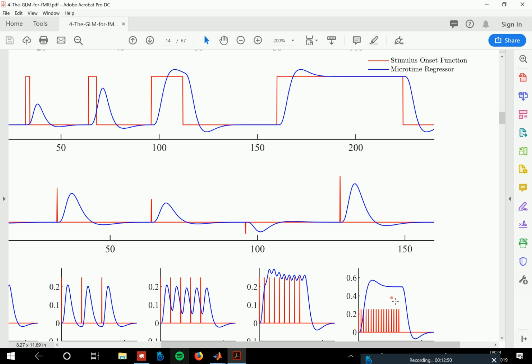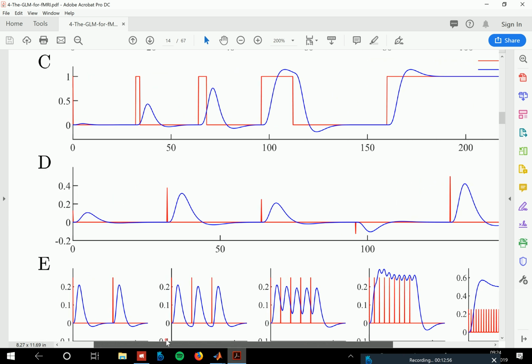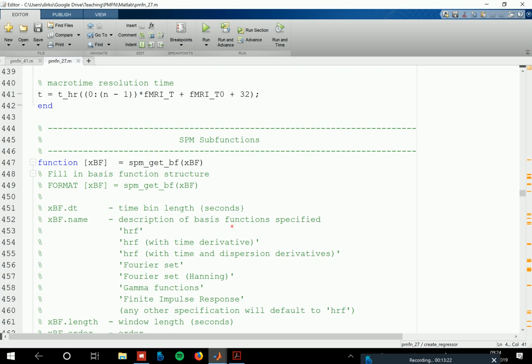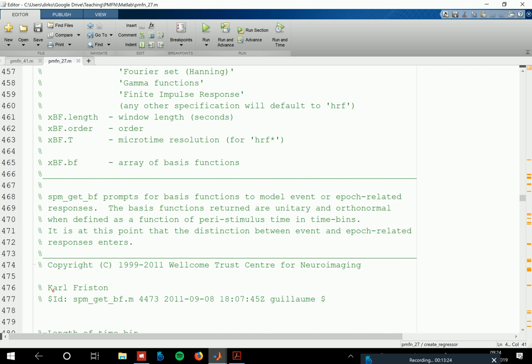you all have the possibility to simulate your GLM, specifically if you are not quite sure whether you should use this extended thing or not, or even just to communicate clearly what effects you want to predict, or how you predict your effects in some fMRI analysis. And you now have the code for it, because this stuff is all done in this function. Of course, you still would have to work yourself into it, and he's the guy who did it all.